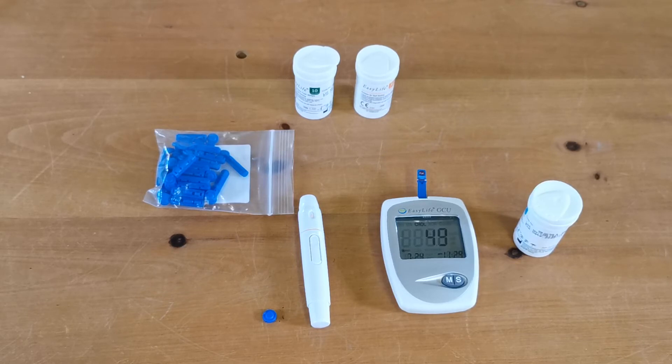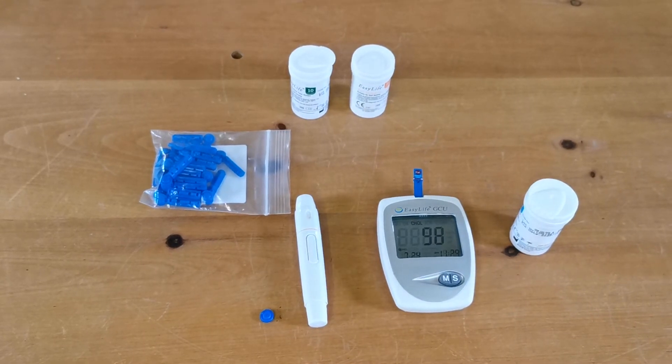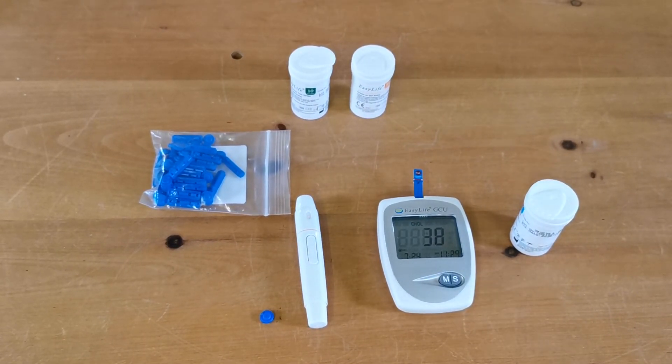We're often asked about the accuracy of these tests. A lot depends on the quality of the lance and the blood sample you're putting into the device. You've got to remember you're using capillary samples that can be diluted or concentrated by the massaging effect when getting those samples out. The more naturally the blood drop forms — particularly with tests such as haemoglobin — the more the results will be in line with venous blood samples.